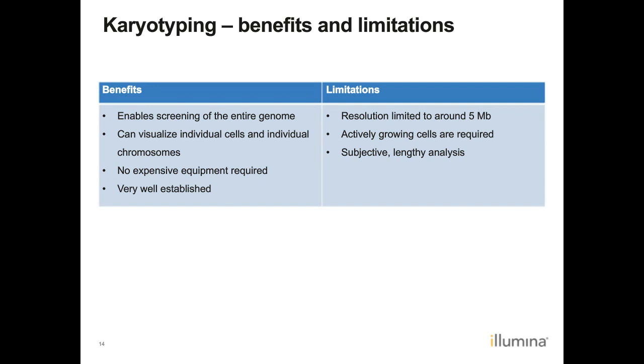the quality of metaphases and sample source. For example, bone marrow samples from leukemia patients can be very difficult to analyze as the metaphases are very tight and banding patterns difficult to read. On the other hand, chromosomes from blood typically produce clear banding patterns, offering better than average resolution.